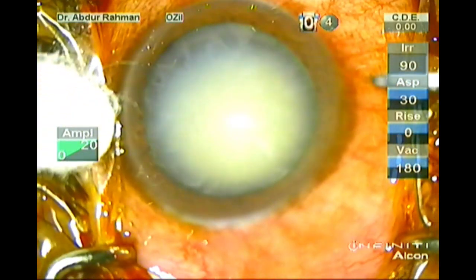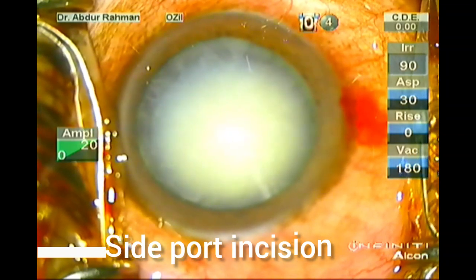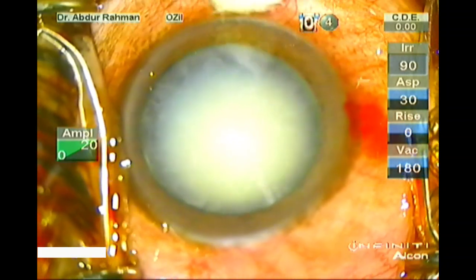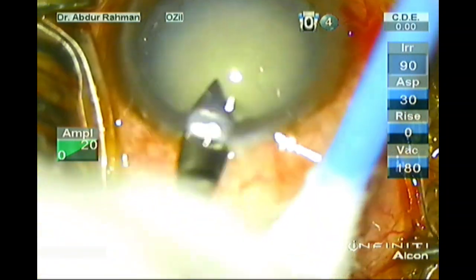Assalamualaikum, I am Dr. Abdurrahman Muhammad Alam. Welcome to today's cataract surgery insights. Today I am performing a cataract surgery in a white cataract.